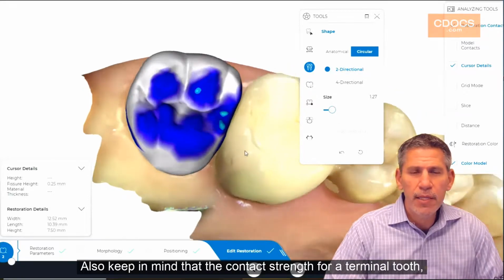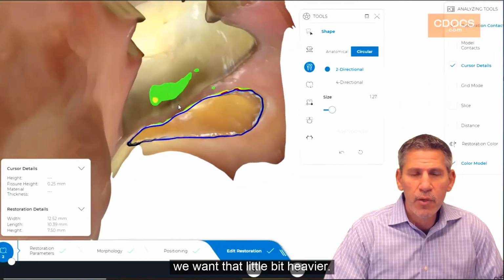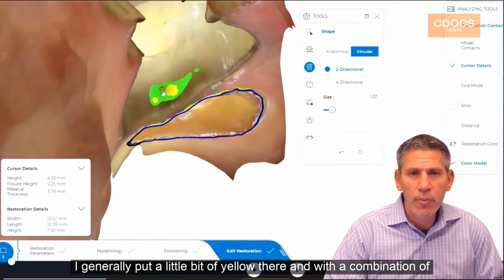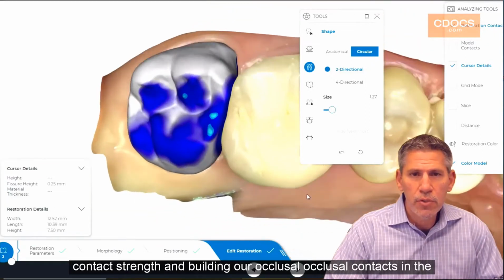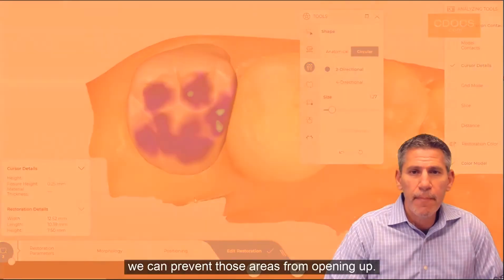Also keep in mind that the contact strength for a terminal tooth, we want that a little bit heavier. So in this situation, green alone isn't enough. I generally put a little bit of yellow there. And with the combination of contact strength and building our occlusal contacts in the correct spots, we can prevent those areas from opening up.